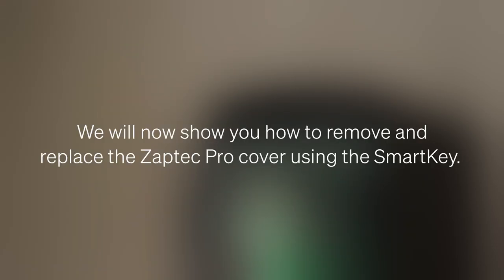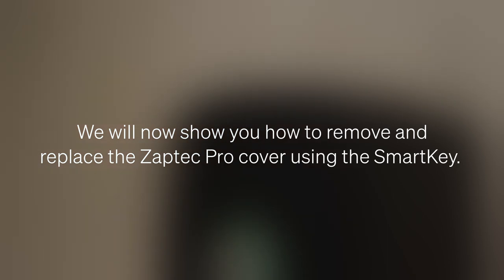We will now show you how to remove and replace the Zabtek Pro cover using the Smart Key.